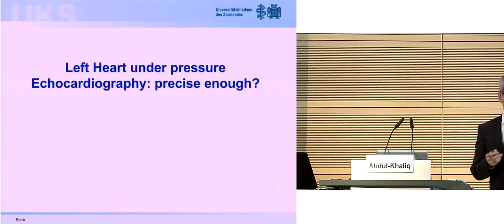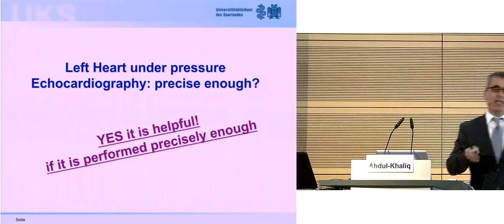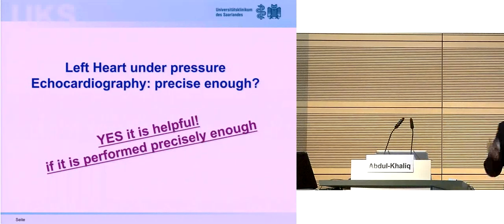So the question for me was, is left heart pressure echocardiography precise enough? I would say yes, it is helpful if it is performed precisely enough. And this is the problem. I think also when you do ejection fraction, you have a variation of 20%. So we pediatric cardiologists, we don't do the echo precisely enough. I can say a lot of pediatric cardiologists, and my department too.